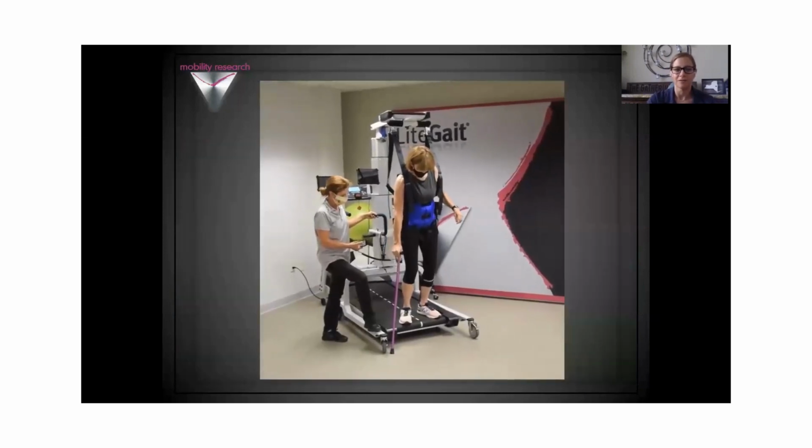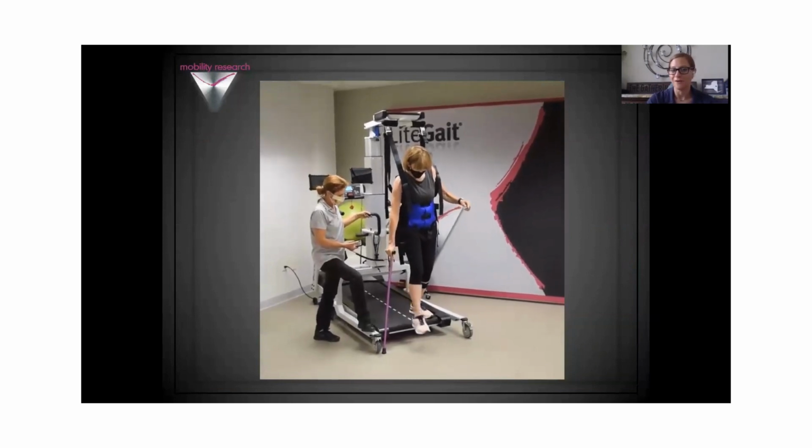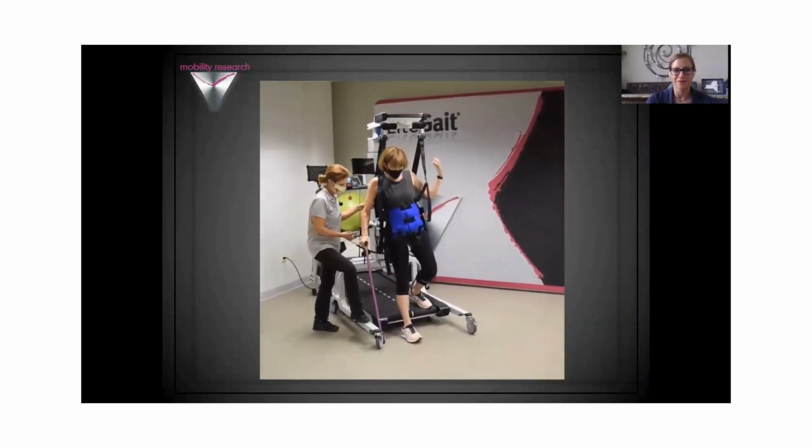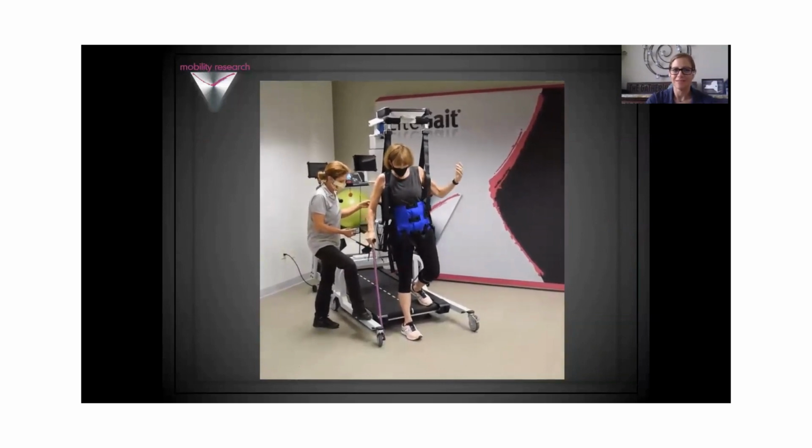Here's an example of a different client who's working on stepping off a curb or stepping down, and you can see she's a bit unsure and needs a little bit of assistance from the LiteGait, but she is not being assisted really by the LiteGait, just there as a safety tool.